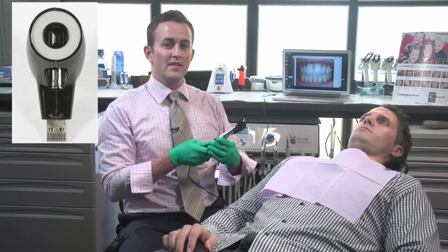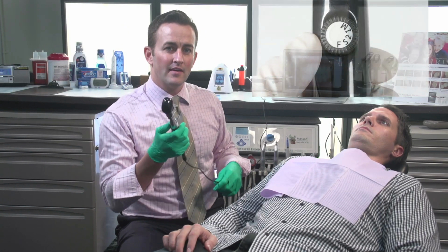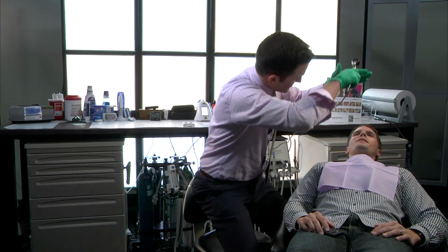Now we're going to go ahead and put it on the F setting. Hold it in a wrench grip fashion with your thumb on the capture button, with your opposing hand bracing the camera. It's going to look a little bit like this.